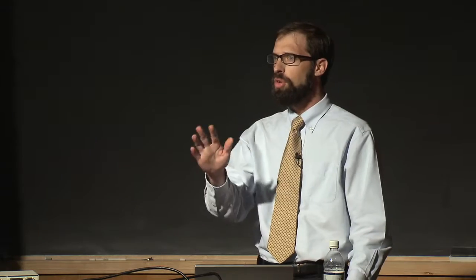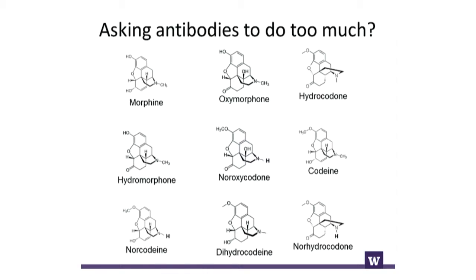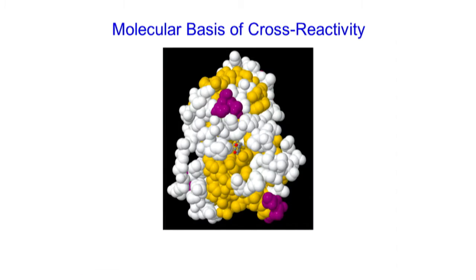So anybody in the middle rows or anybody in the back row, it's going to take you a little while to try to figure out what's different between each one of these molecules. But once you figure it out, you'll say, okay, well, I got those two. Now how is it different from that other one? It'll take us a long time to figure out how these molecules are different. And that's part of the problem with immunoassays, trying to detect small molecules and differentiate them from all the other small molecules.